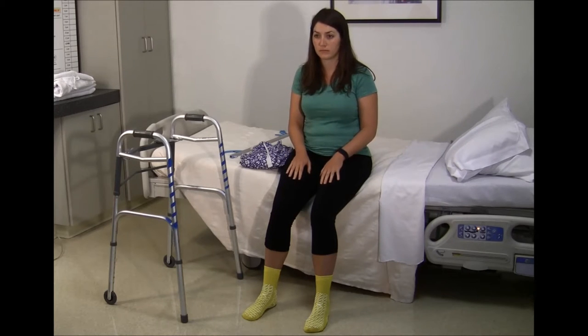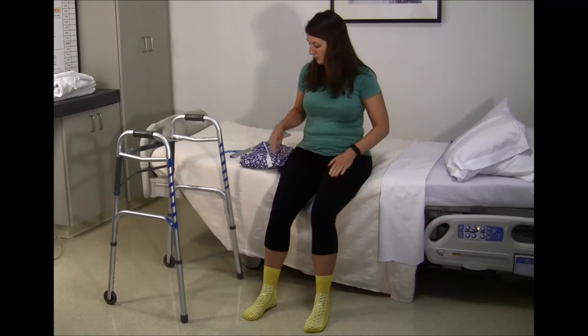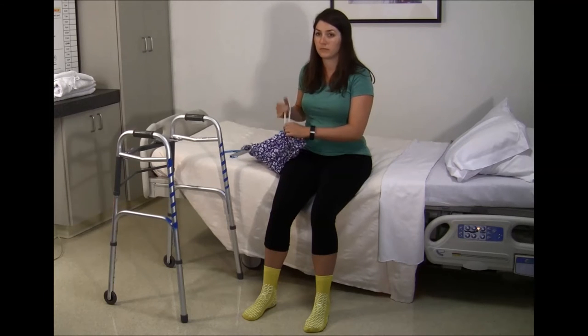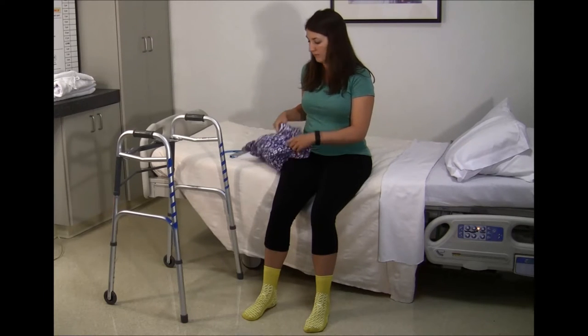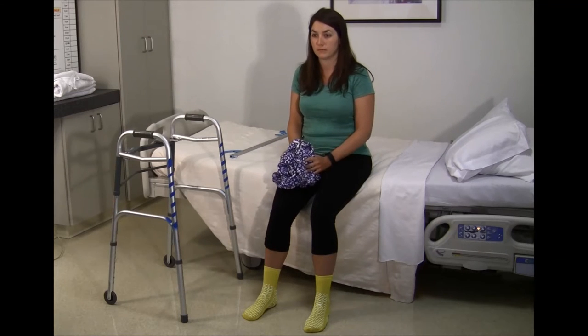When using the reacher to get underwear or pants on, you will always want to remember to dress your operated leg first. For a hip replacement patient, you cannot bend forward in order to maintain your hip precautions. The reacher ensures you can get down to your feet without bending too far forward at the waist.